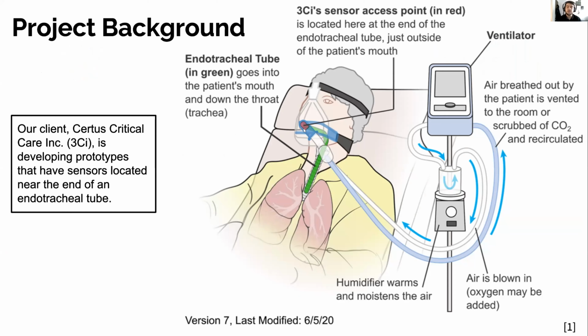Our goal is to simulate the environment created by the patient at the sensor access point. 3CI would like to know how their electronics may be affected by this unique environment and have tasked us to build a simulation device, which we have named the Googun.